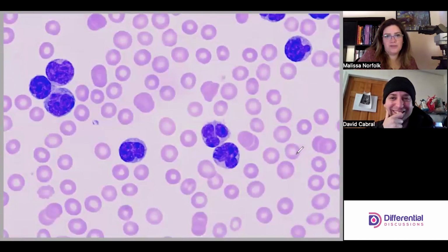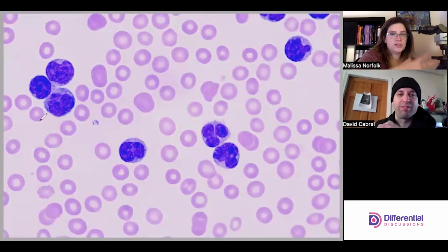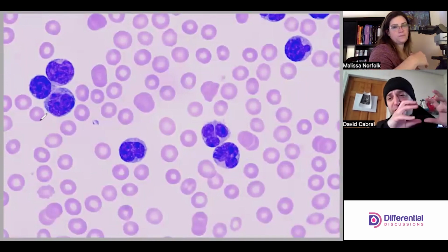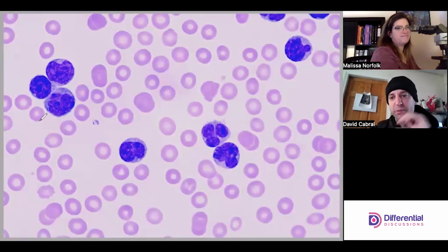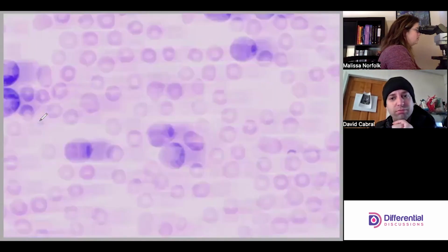So all lymphocytes. I think this one has some nice, really dark areas of heterochromatin in it, like you were talking about on the regular slide for the soccer ball. There's not a lot of white striations, so we don't see it as much as a soccer ball, but you can see the heterochromatin. Always be suspicious when you see cells clumped together, because it's statistically very improbable for normal cells to be touching like that. And then there's a guy over here.